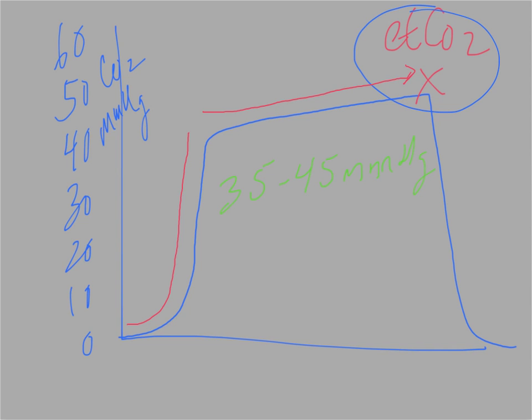Now, looking at this waveform, we can see that we're relatively square in shape. Okay, and remember we talked about the alpha angle. That alpha angle is about as close to 90 degrees as we can get, and normally it's 110 degrees. I only say that for illustrative purposes. People freak out all the time. We're paramedics and we don't like math or angles or numbers for that matter. But that's really about the extent we'll get into that. It's important to remember what a normal waveform looks like, and if we don't have that, we need to investigate as to why.